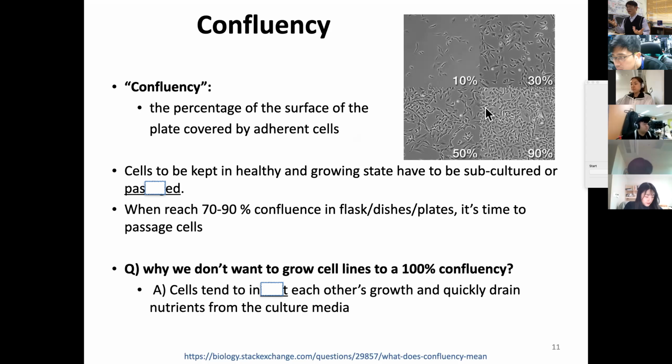Multiple experiments. So typically what happens is you grow the cells, and before reaching 90%, you have to take out the cells because there are too many cells in one dish. You actually have to suspend the cells. Let's say there are 3 million cells inside, then typically you divide by 2 or 3. So with 3 million, you take out 1/3, 1/3, 1/3, and then you pour those cells into 3 new culture dishes. That we call subculture. Then you start with 30% or 10% again, and you grow them.